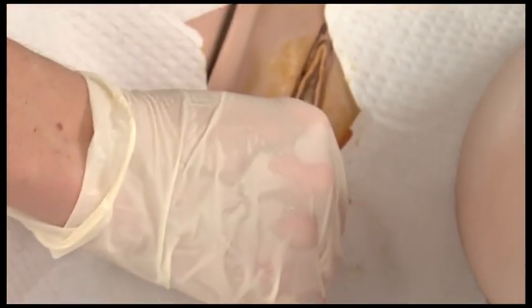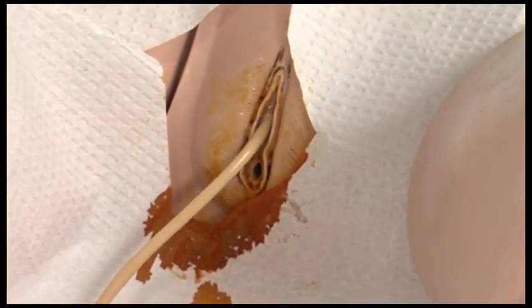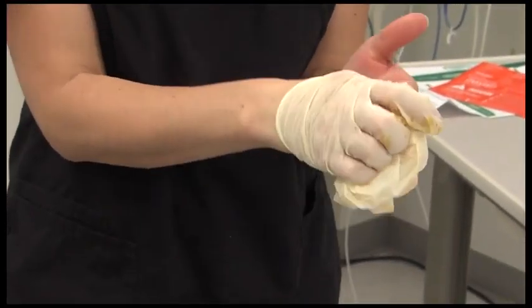Deflate the balloon, gently advance the catheter, and inflate it again. Once the balloon is inflated, gently pull the catheter until the inflated balloon is snug against the bladder neck. If successful catheter insertion is not completed, including breaks in aseptic technique, replace the catheter and collecting system using aseptic technique and sterile equipment. If proper catheterization is not accomplished, use a new catheter system. After inserting the catheter, discard all materials in accordance with hospital policy and remove contaminated gloves.